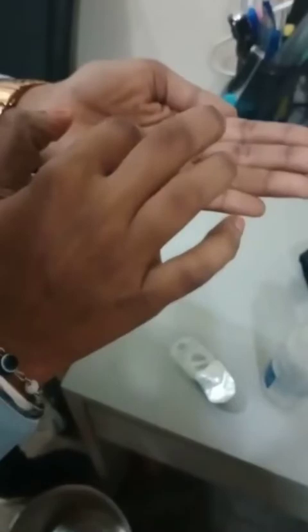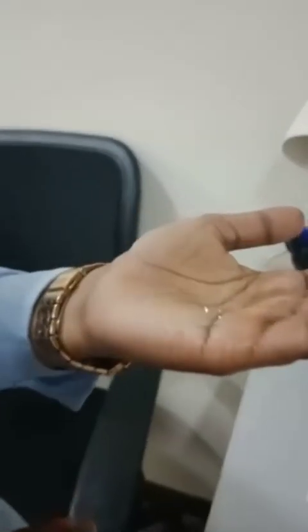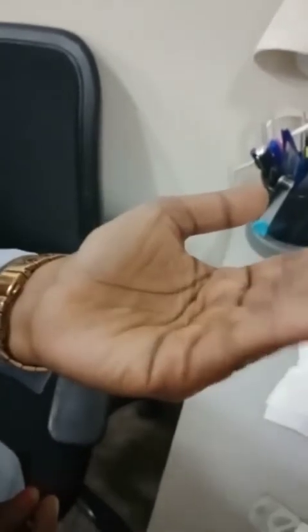Before positioning the lenses for insertion, make sure the lens is in the correct position. The first method to check correct positioning is the taco test. Place the lenses on your palm and squeeze the lenses. If it curls inward, it's in the correct way. If it curls outward, it's in the wrong way.